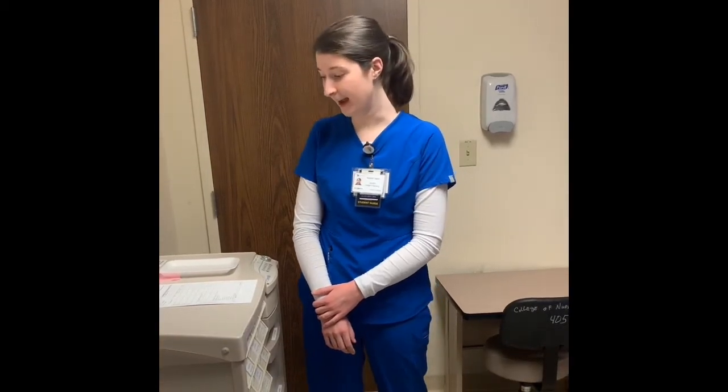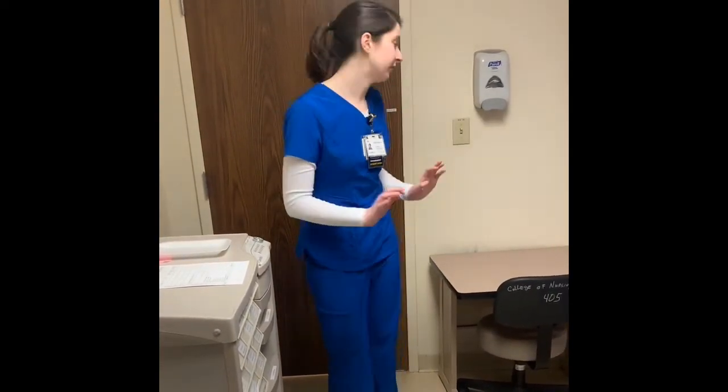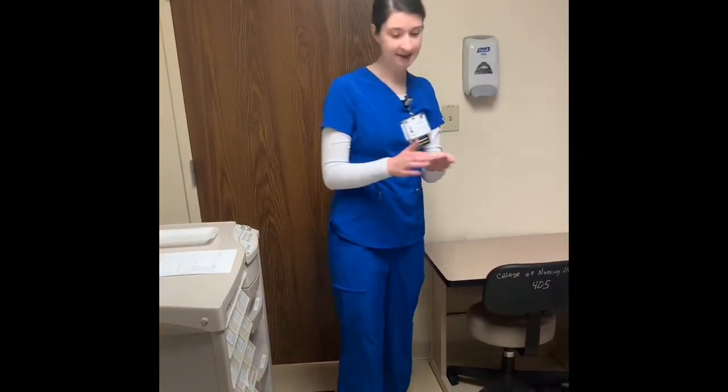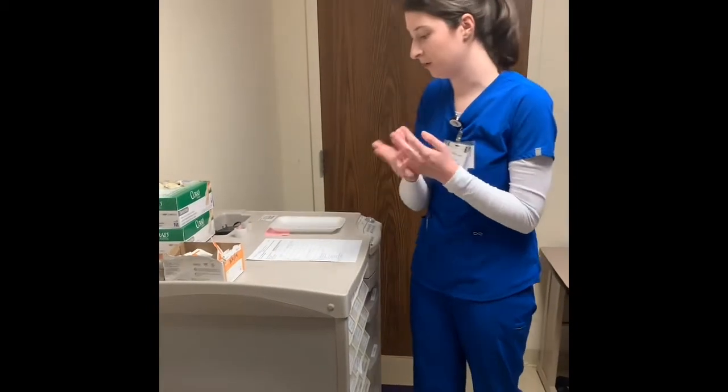Okay, so today I have a medication order provided to administer some regular insulin to a patient. So before I start with any of the medication administration, I'm going to go ahead and wash my hands. So this medication order is for the patient Carmen Guadalupe.